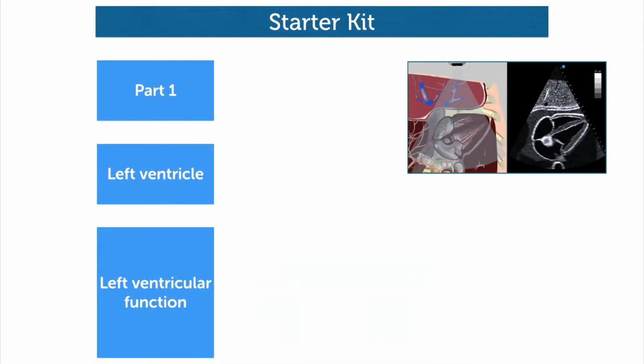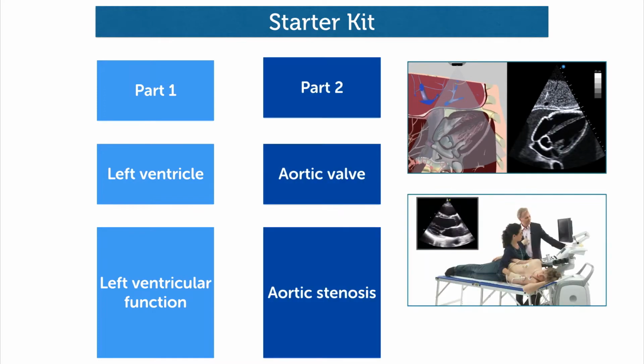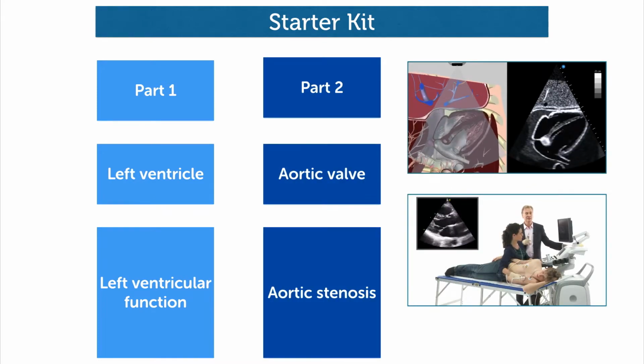Hello and welcome back. This is the third and last part of our echo starter kit. In part 1, we showed you how to quantify left ventricular function. In part 2, we talked about aortic stenosis, and now we'll talk about another topic.